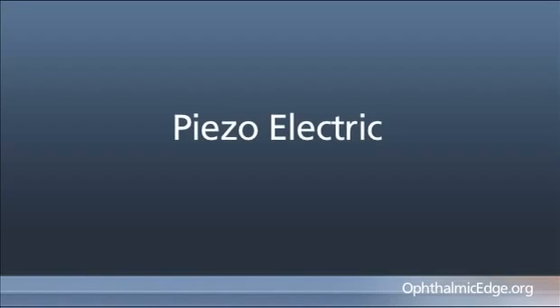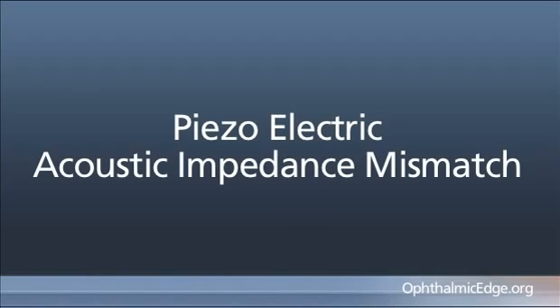And we talk about acoustic impedance mismatch throughout diagnostic ophthalmic ultrasonography. That's really what you're reading. All the images that you see on the screen are really a result of these two phenomena: piezoelectric phenomena and the acoustic impedance mismatch of tissues.